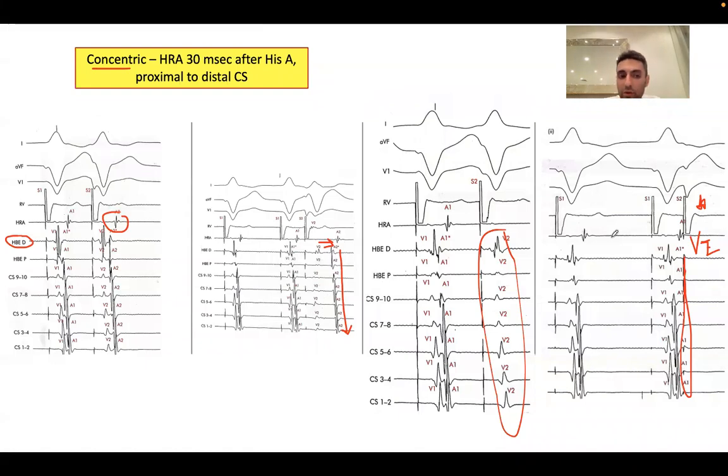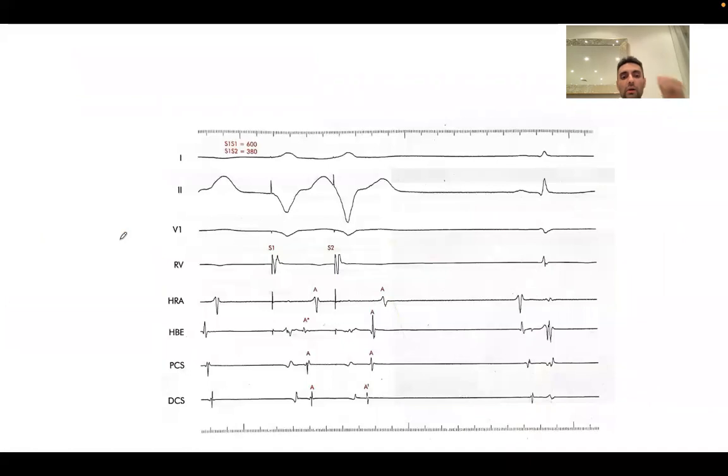Then it would be nice if you include such information in our charts, okay? For future references. Sometimes you see a sudden VA decrement and then a jump; this is called a retrograde VA jump, okay? And so forth. Okay, and this is another example.